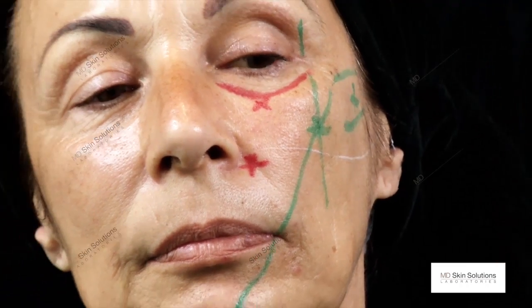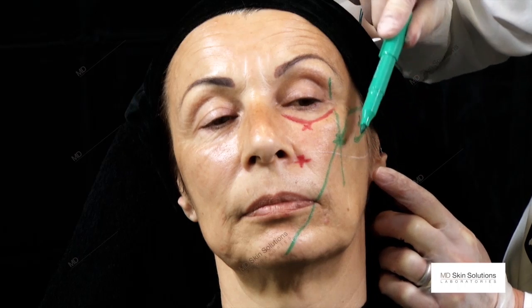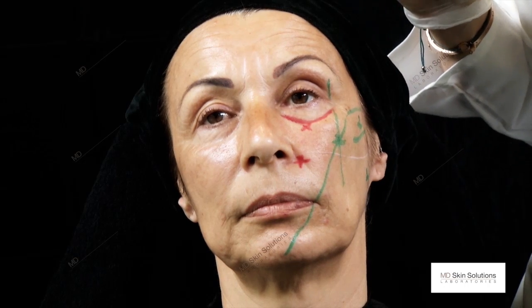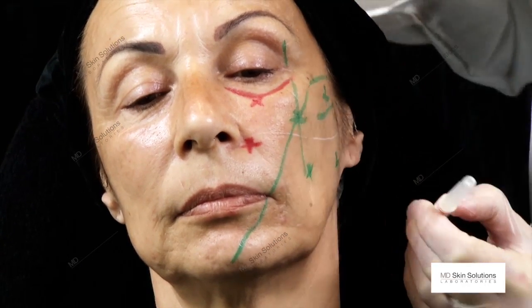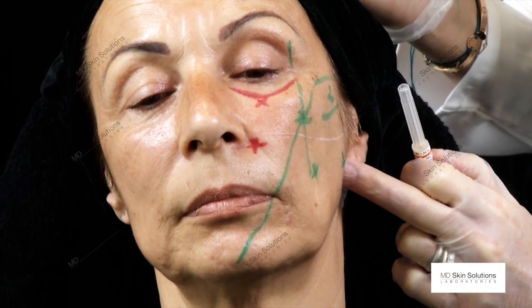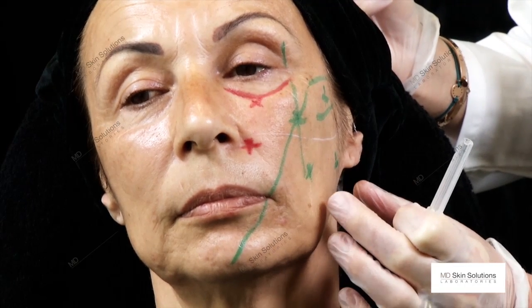If ever we do a strengthening of the lower part of the cheek, my entry points will be here, and then according to the cannula length, and again I use the same one, we would do the next entry point here. So this would be the augmentation of the lower part of the cheek. I use that predominantly for the wrinkly skin here to stimulate the structure.